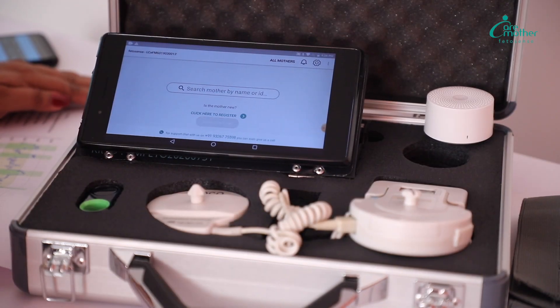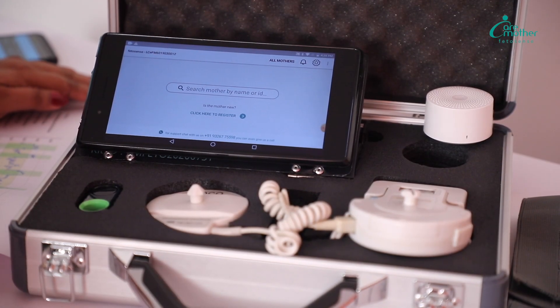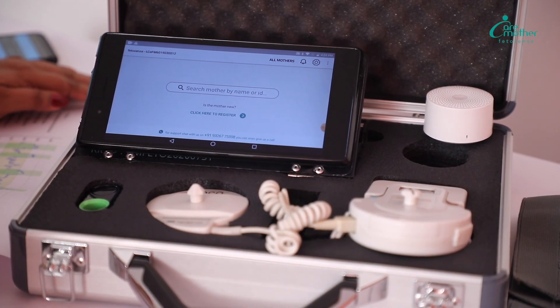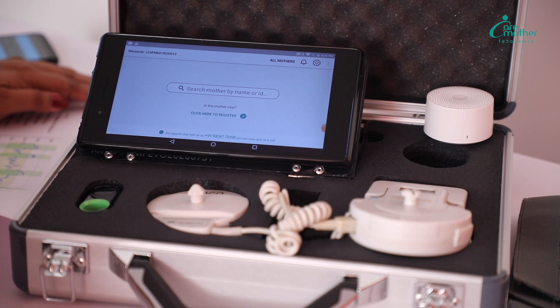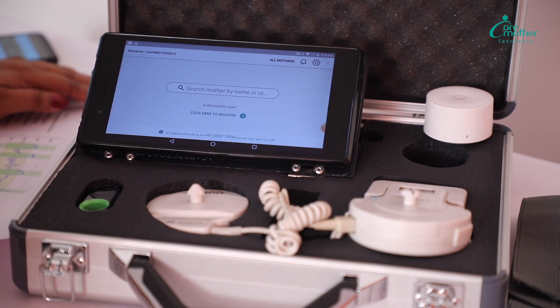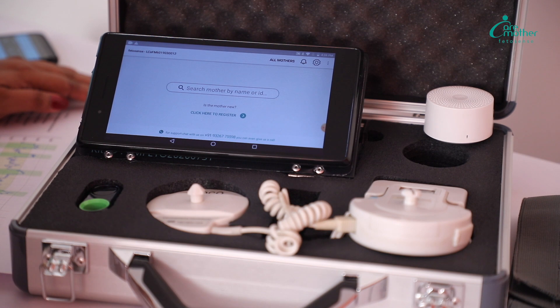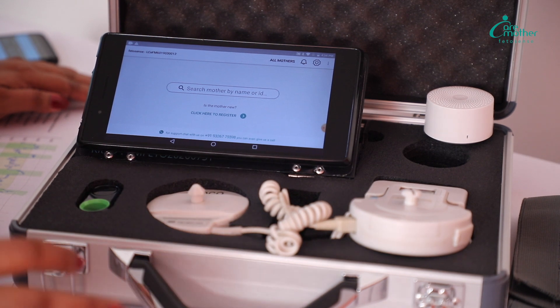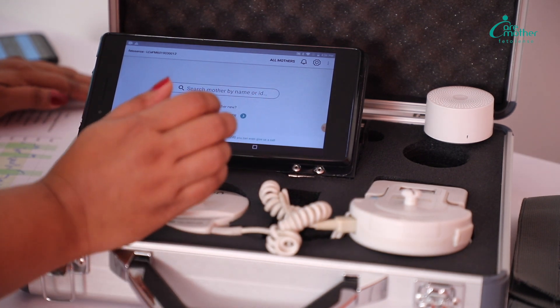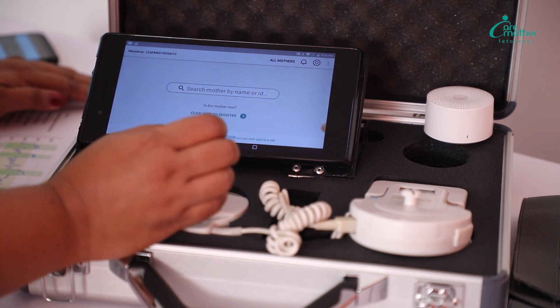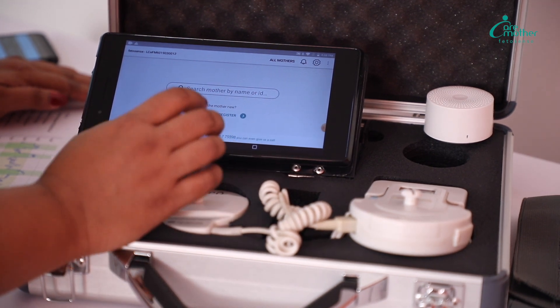The next feature on this device is unlimited cloud storage of patient data. Whenever you do a test on this device, the test is auto-saved in the form of a PDF.